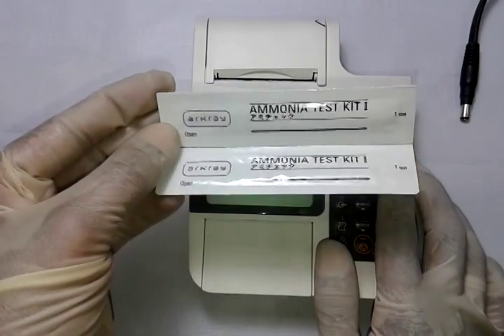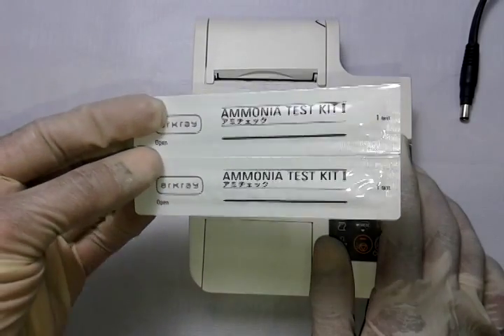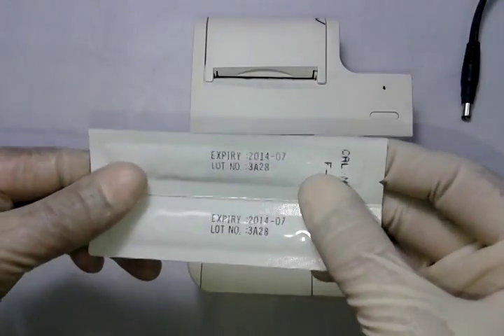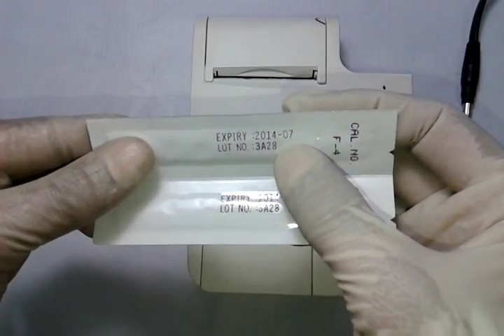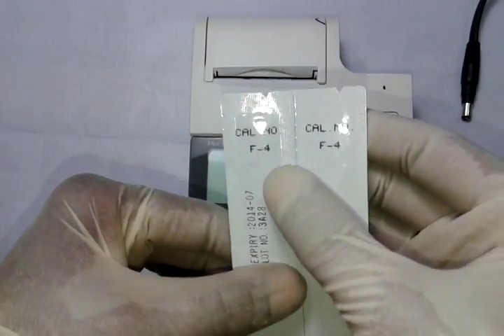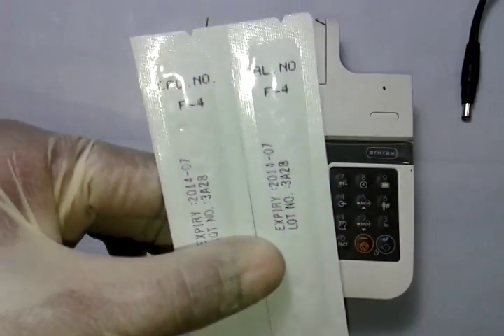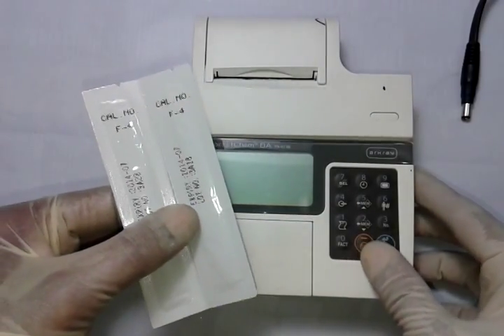Here there's an advantage: all the ammonia strips provided with the Pocket Chem BA are individually aluminium foil packed. You don't need to refrigerate them — they can be kept at room temperature and come with an expiry of one and a half years, 18 months. The strips I'm holding expire July 2014, and each batch comes in a pack of 50 with a unique code number — this batch has code number F4.